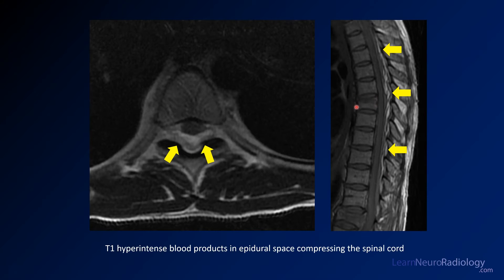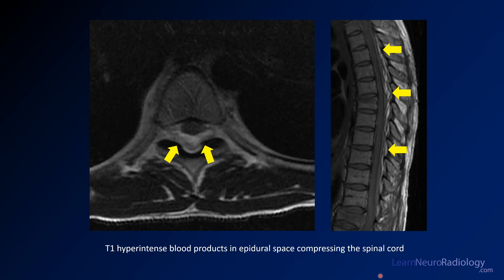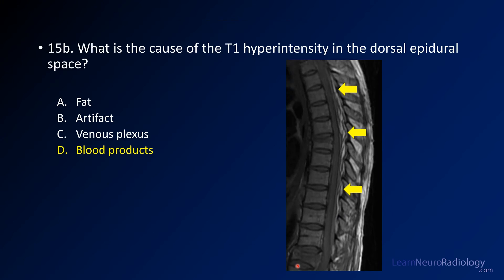You also see the fractures. Many times you'll already have CT on these patients, so you may know there are fractures. You see at least two compression fractures here, possibly more, and that's what's leading to blood collecting in the spinal canal.